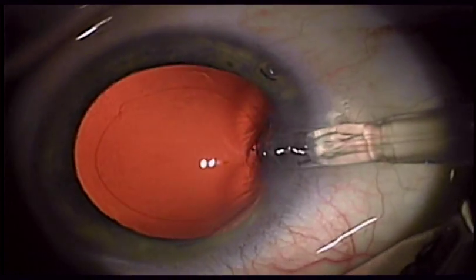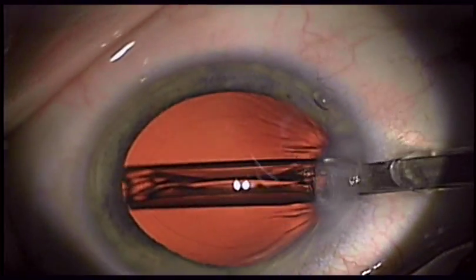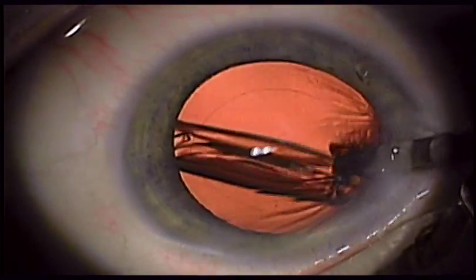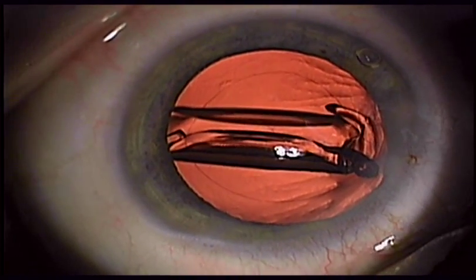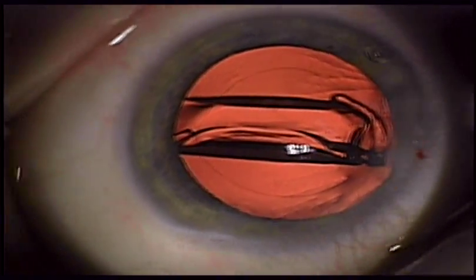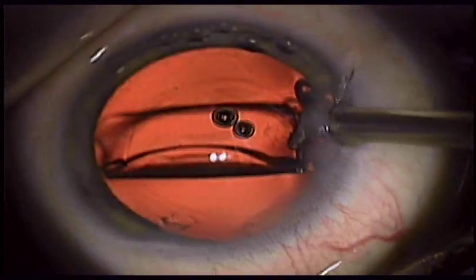It has a double square edge to help inhibit PCO migration, and the optic is offset from the haptics to help facilitate centration with the visual axis as well as to keep the eye well centered. This lens is not intended for sulcus fixation.